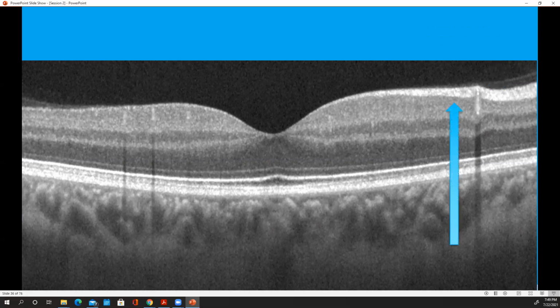How about that layer that's dark underneath it, albeit it's not perfectly dark. It's a little weird looking. What is that layer? Do you know? The ganglion cell layer? Correct. So the ganglion cells are like super VIP cells, and they really are, to be honest with you. That's where everybody sends their information. Ganglion cells get a layer named after them. But it's still a cell. Cellular, meaning it's going to be a little bit darker than the guy next to it, because it has fluid and cellular material, whereas the nerve fiber layer is super packed with just dense axons. Does this make sense? Yep. Okay, so I'm going to point again.